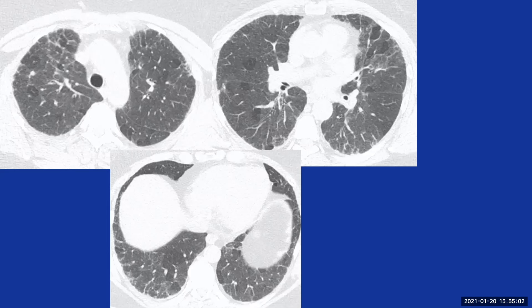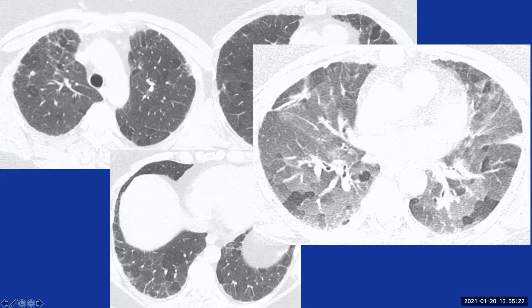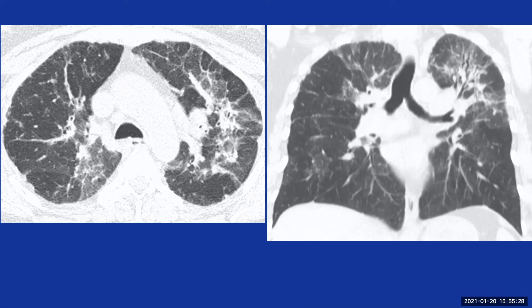Another example: three sequential axial images show zonally diffuse or random pulmonary fibrotic distribution with superimposed mosaic attenuation — dark areas marginated by the edges of secondary pulmonary lobules. On expiration, these areas remain equally black, confirming true air trapping. This is a typical fibrotic HP pattern. A further example in axial and coronal planes shows mid and upper lung preponderant fibrosis with superimposed ground glass opacity and clear mosaic attenuation — a good example of the three-density pattern with typical fibrotic HP.